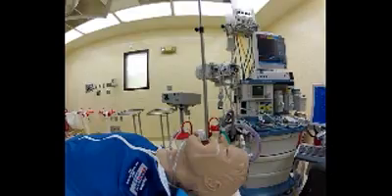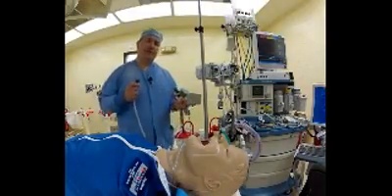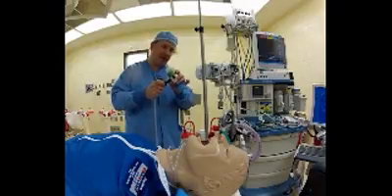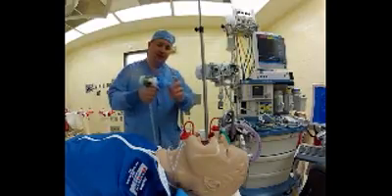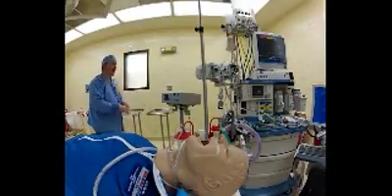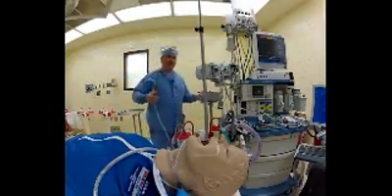The oxalator is a very simple device that really only wants two things in life. It wants a supply of gas — either oxygen or air — between 40 and 90 psi. And it wants an open airway. You have to give it both or it won't work.